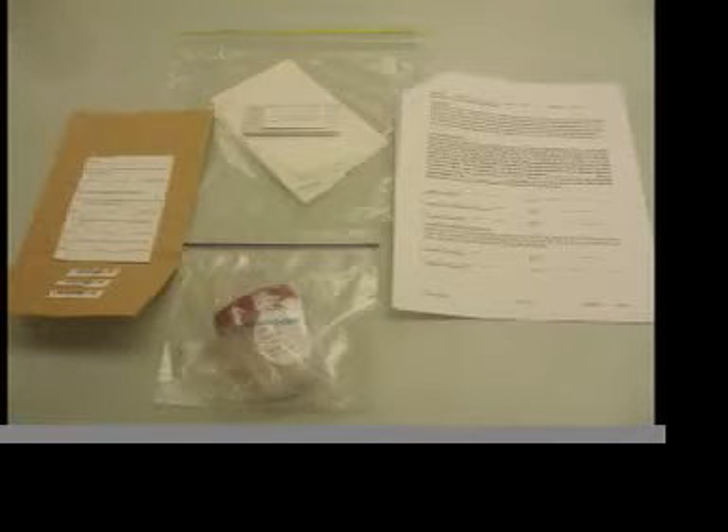If you have agreed to participate, you will be receiving a collection kit in the mail. It includes a collection cup for urine, the paper bag that it goes in, your consent form, and a bar of soap and paper towels for you to clean your hands.